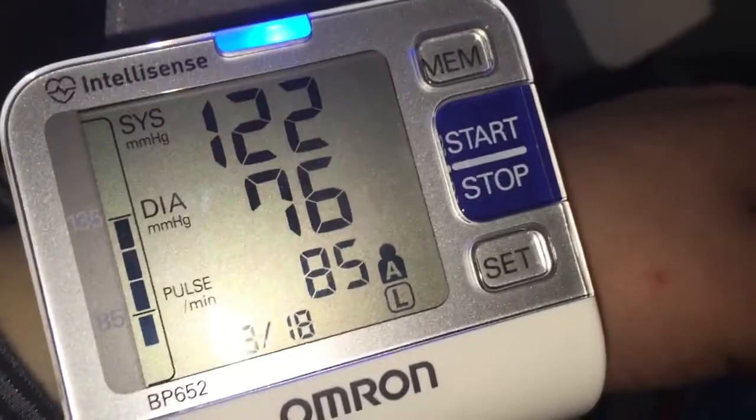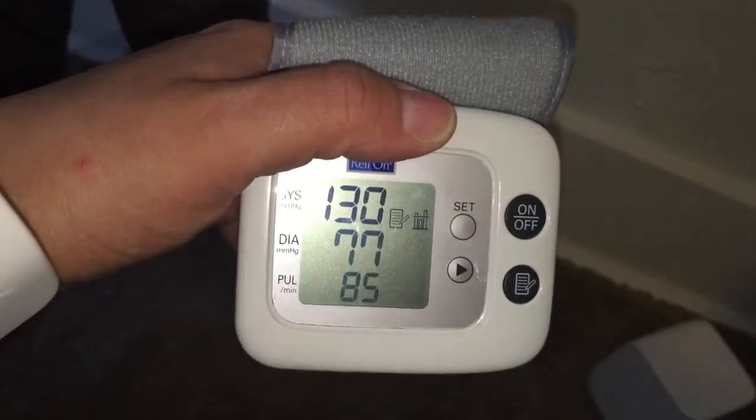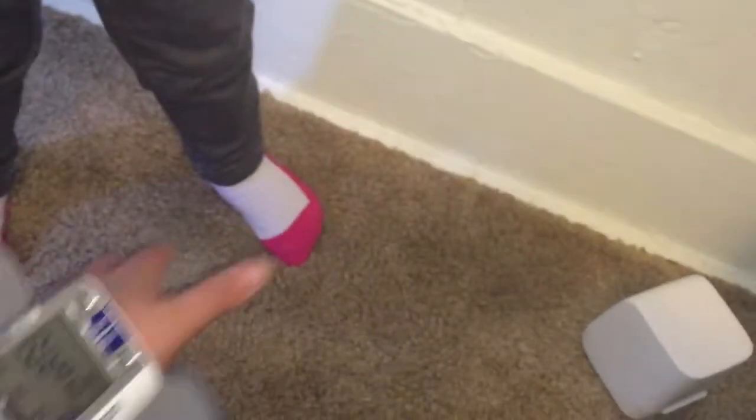The Omron reads 122 over 76, pulse 85. My little one was messing with the RelyOn so I'm not sure what it was showing at that point.